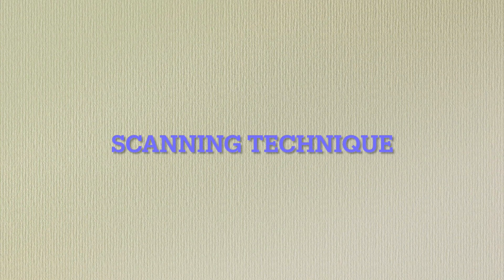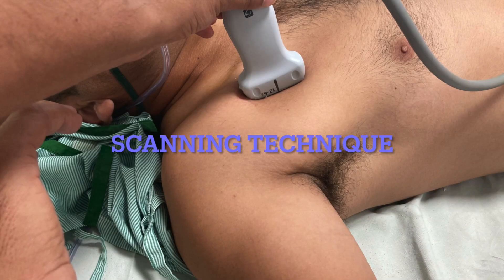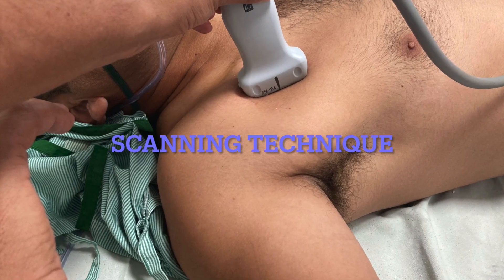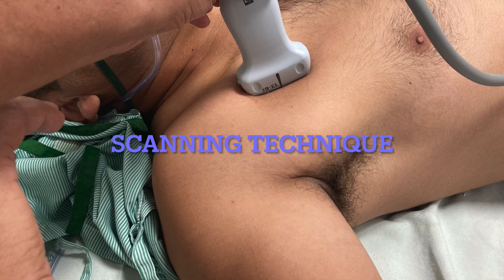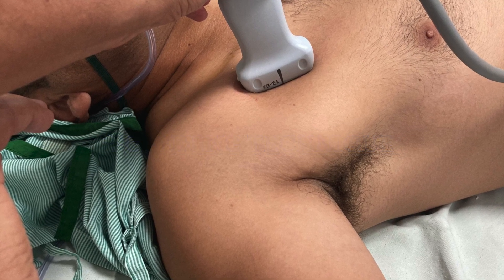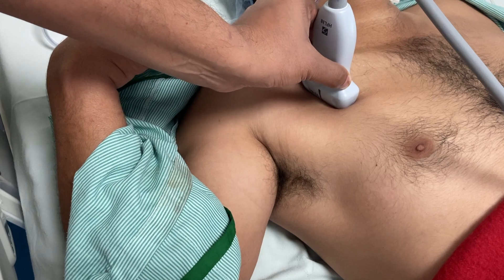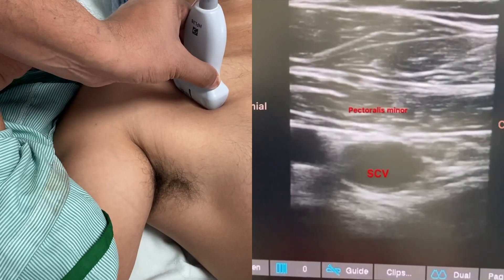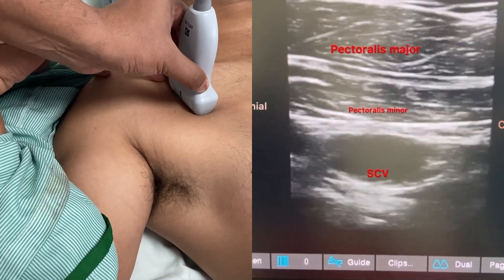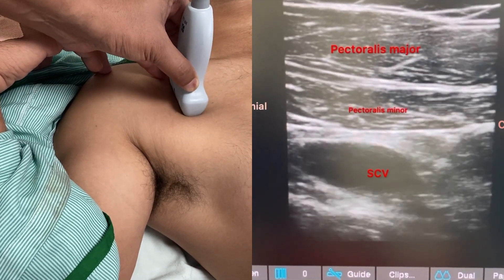For the scanning technique, first place the high-frequency linear probe just below the lateral one-third of the clavicle in a parasagittal plane, then rotate slightly toward the axilla, keeping the vein and artery in view.